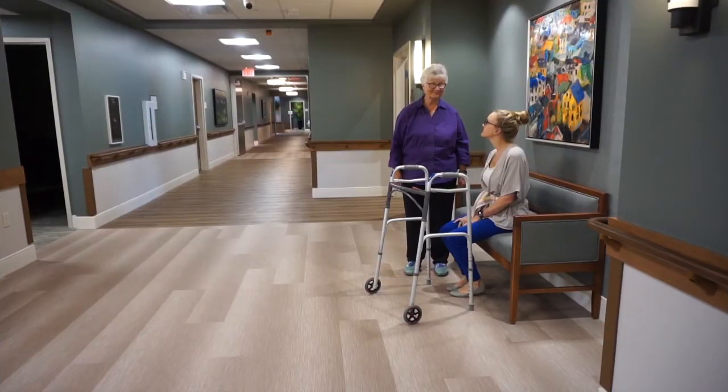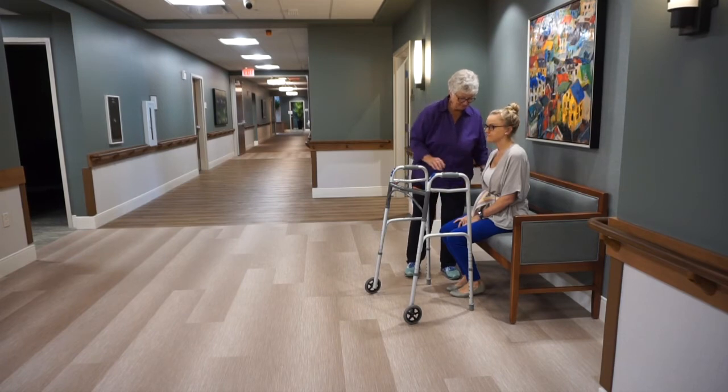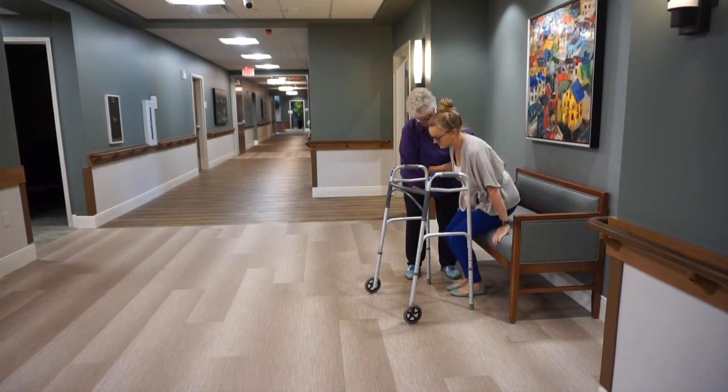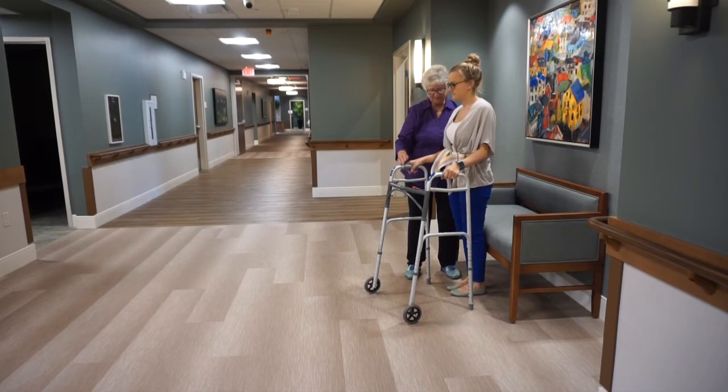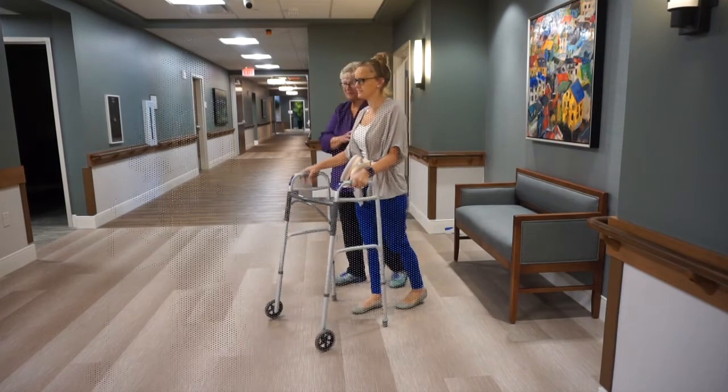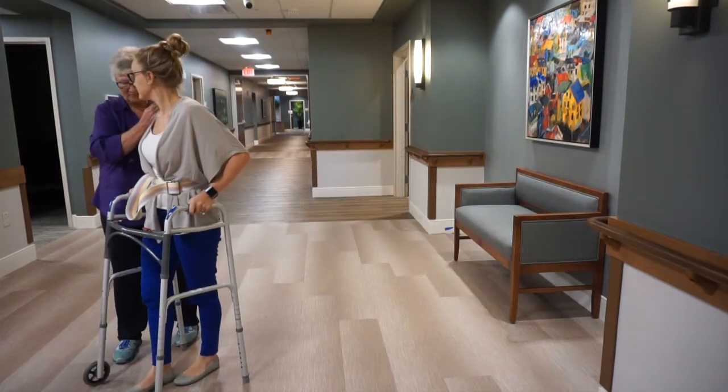Place the walker about 1 foot in front of the person. Make sure all 4 wheels or legs are on the ground. Encourage the person to grasp the bar with both hands, one on each side. The person should be walking inside the walker for support, but not right up to the bar.